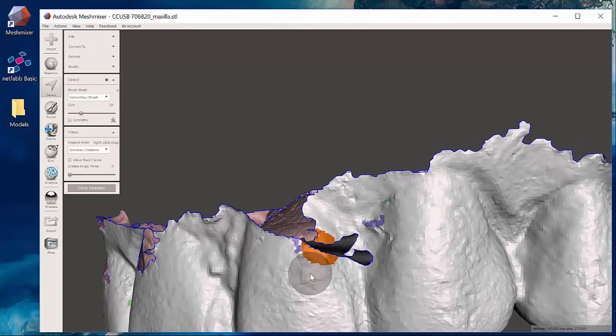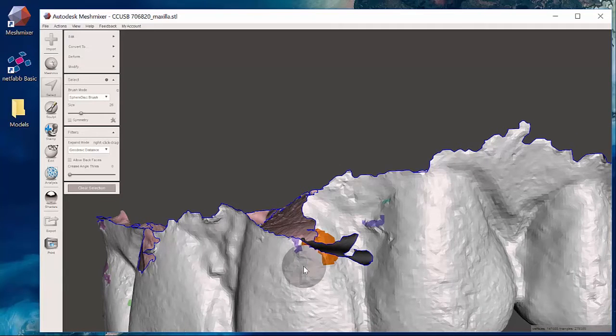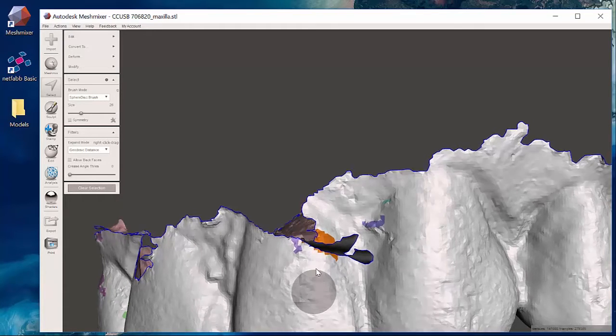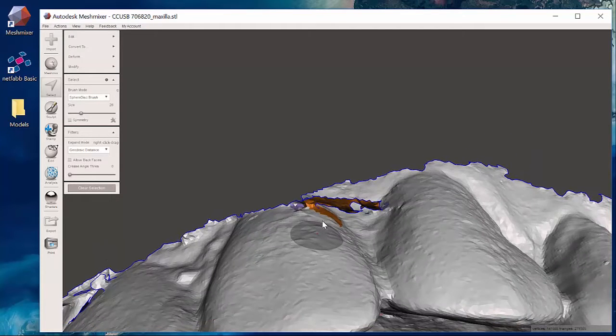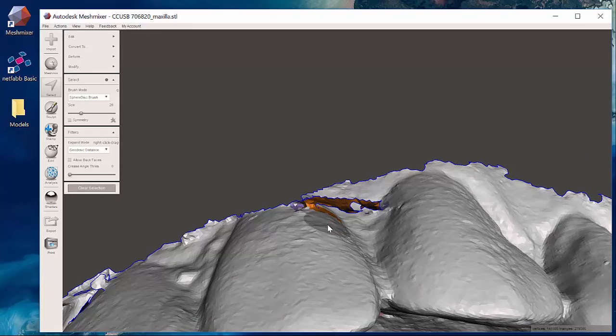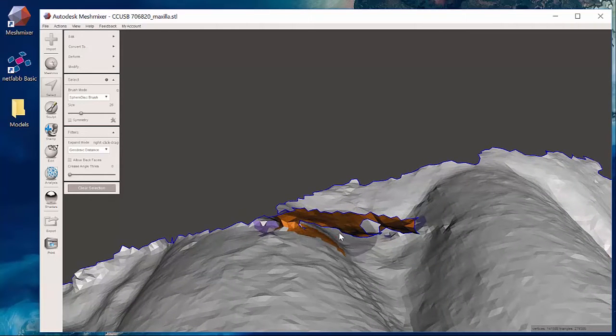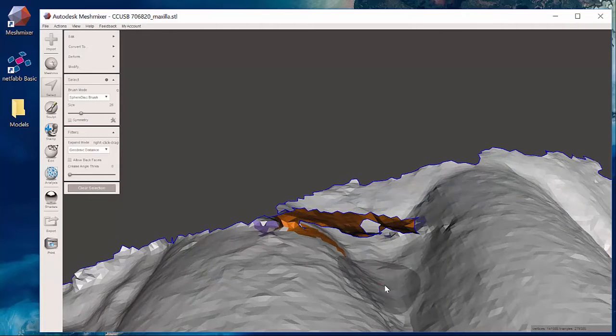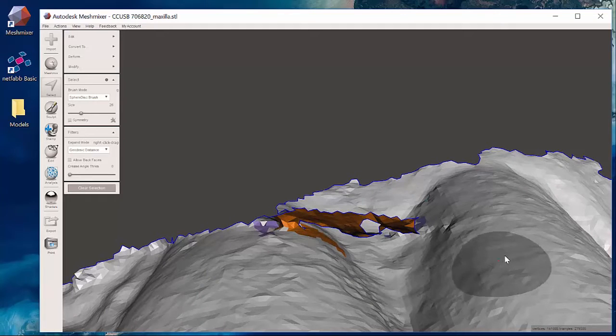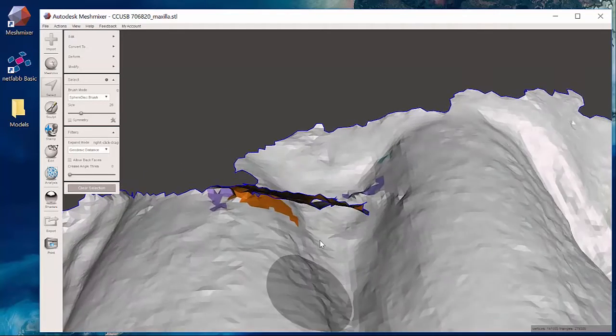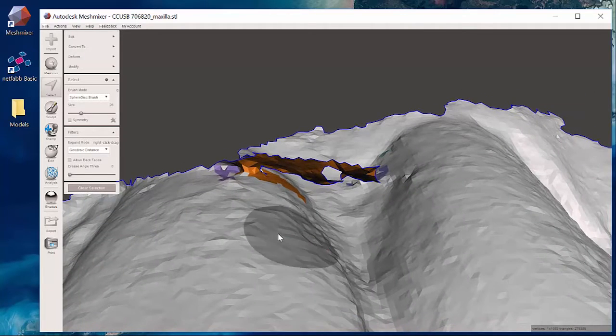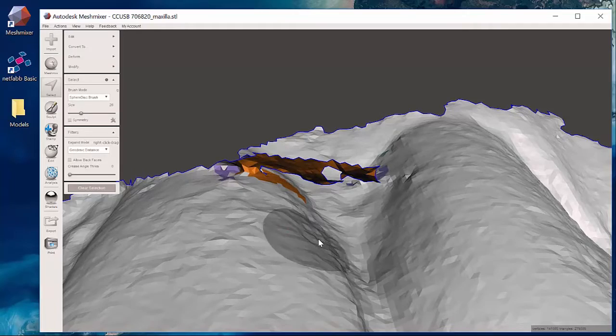If I hit the control button on my keyboard and left click while holding control it will deselect. Notice that this little dark circle as I wrap on a three-dimensional object, it actually traces in three dimensions. So notice here how it drops into the embrasures.